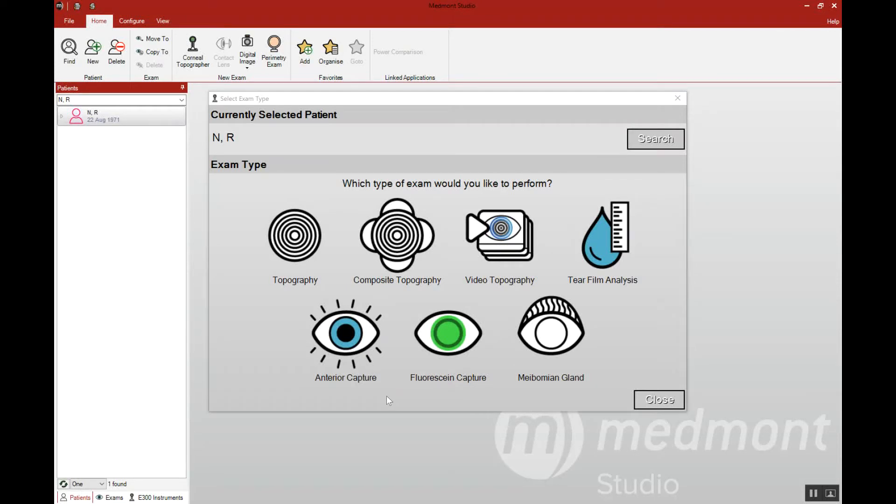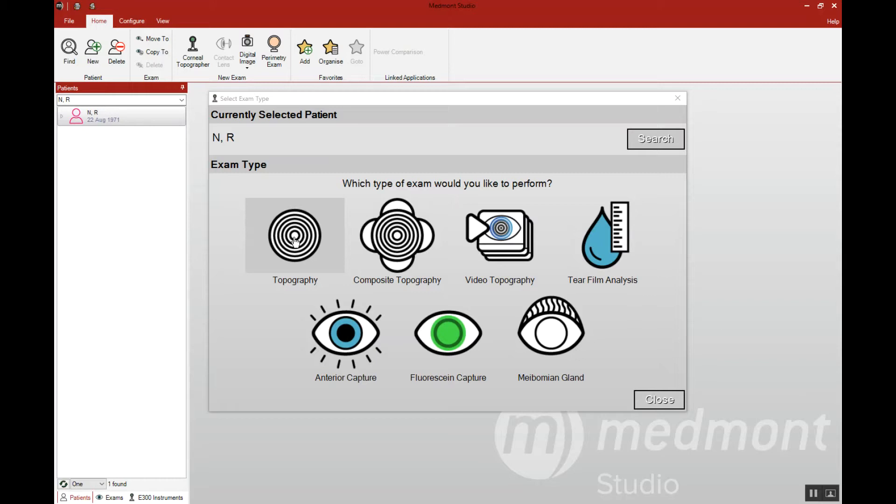This video reviews the composite topography capture. There are two types of corneal topography that you can collect. A single topography would be this icon here and that's one single image capture of the eye. Whereas the composite capture will merge various fixations together to create a larger view of the eye.